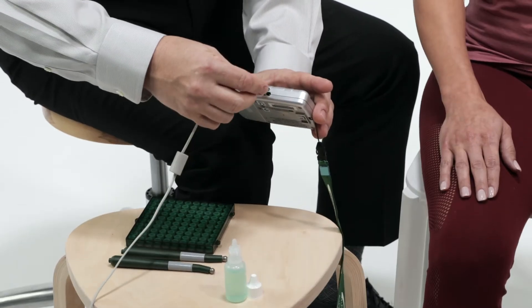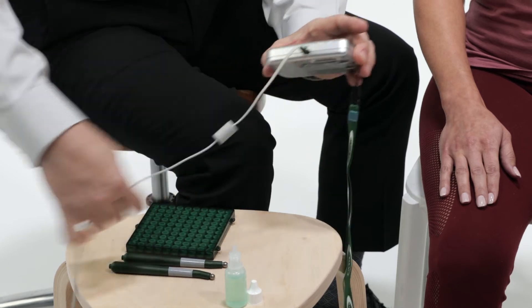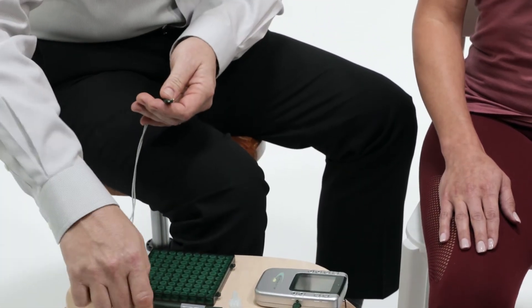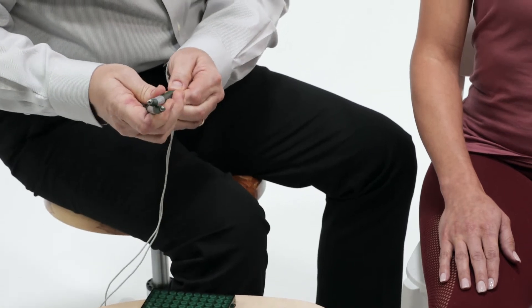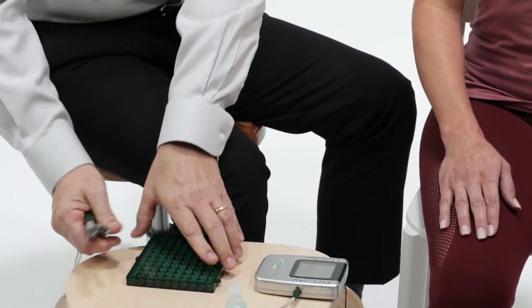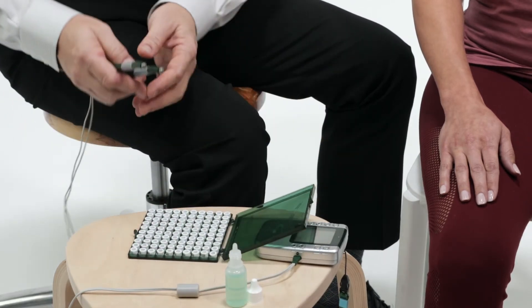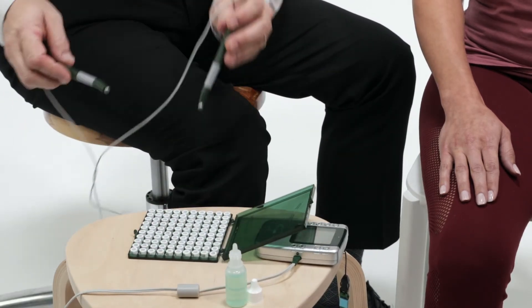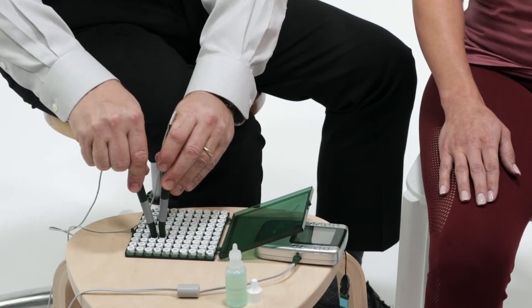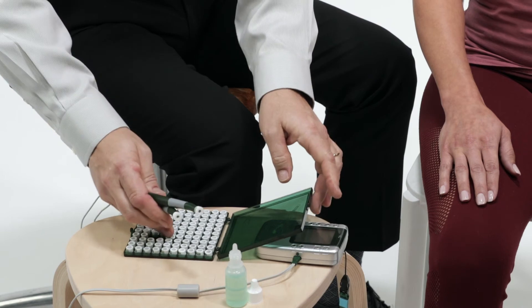Plug lead wires into the Alphastem M and pin plugs into the smart probes. Either channel, one or two, will work. Apply probe electrode pads to probes by placing the clean probe tip into the PEP in their green case. The case opens with the label on the bottom to prevent pads from falling out.